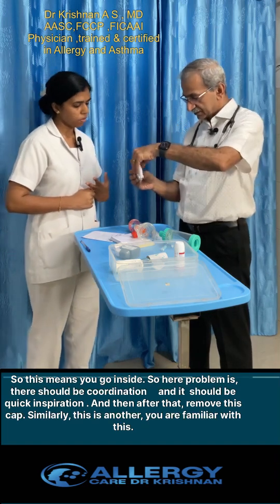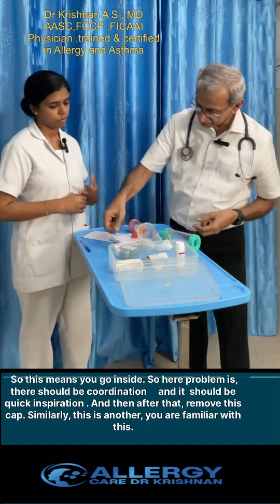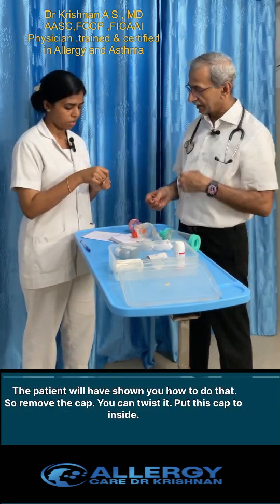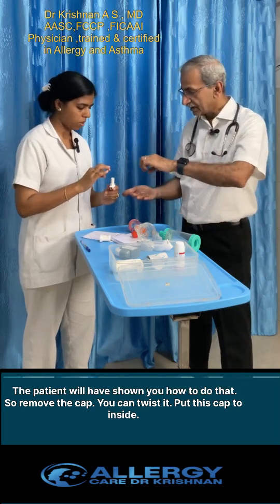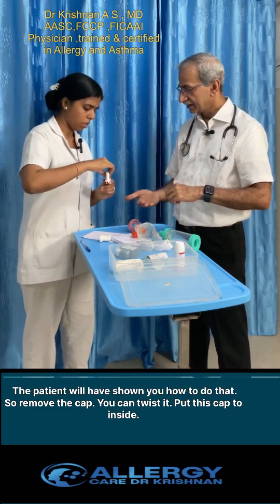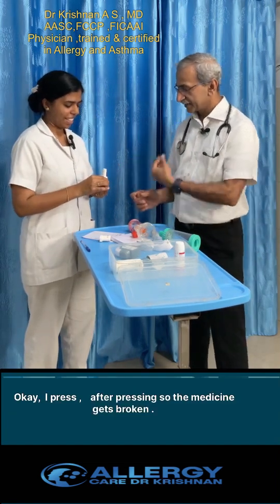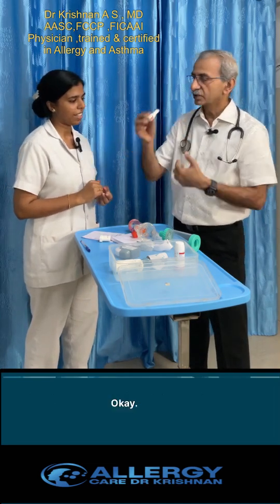After that, remove the cap. This is another type of inhaler — you may be familiar with it. You remove the cap, place it, and put the capsule inside. Then press — after pressing, the medicine capsule gets broken inside so the medicine is released.